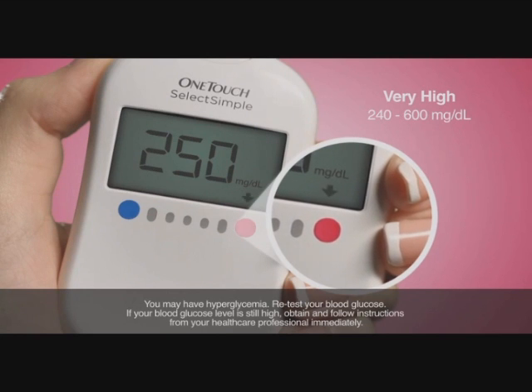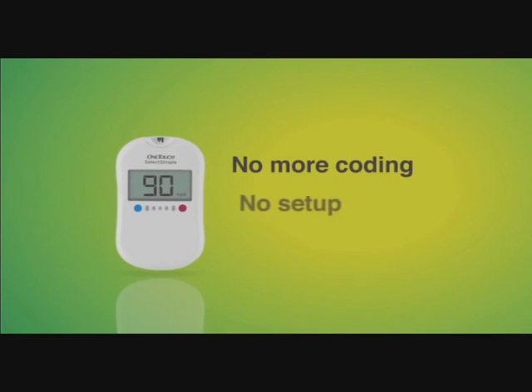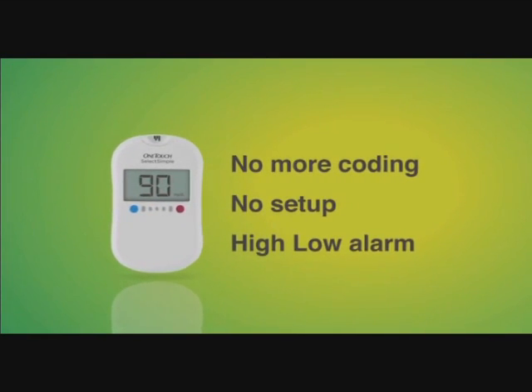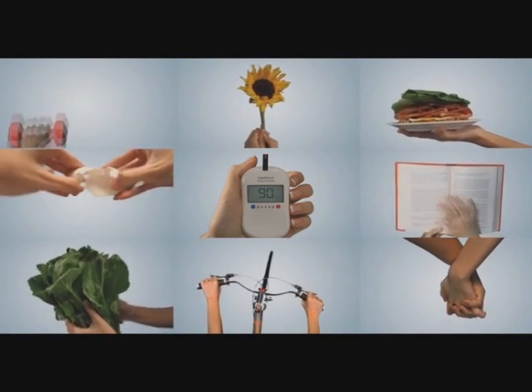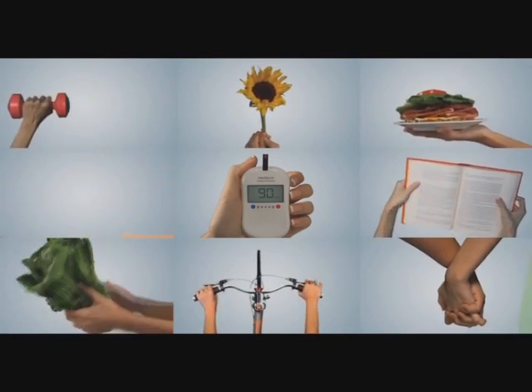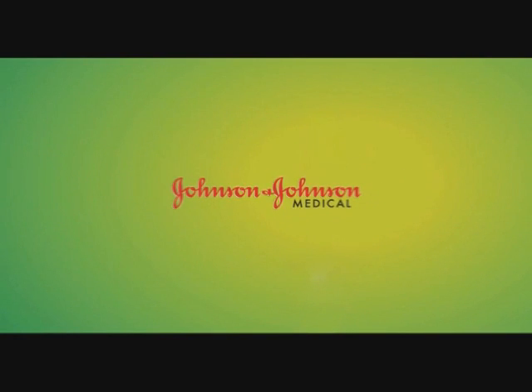This means your blood glucose level is extremely high. OneTouch Select Simple — gain peace of mind to make the dietary and lifestyle choices to keep your blood glucose levels in range. Johnson & Johnson, the trusted brand preferred by diabetes specialists worldwide.